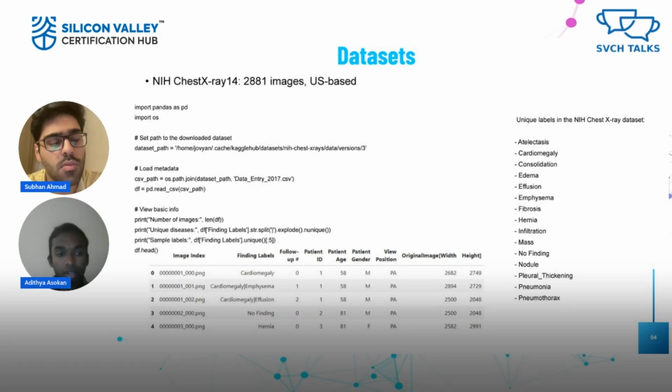Then we had a CSV file which had the labels of all the diseases, not just pneumonia or normal. We had many other diseases, but our aim was only to detect normal and pneumonia. So we checked all the unique labels first, removed the other labels, and kept only pneumonia and normal images, to make our machine learning model better.